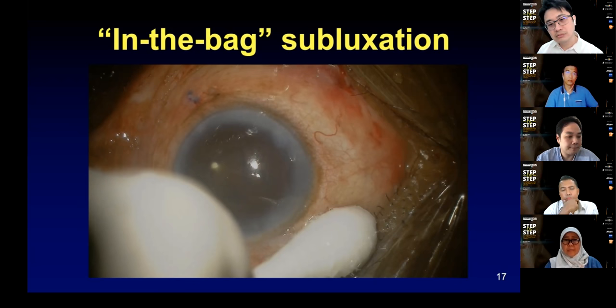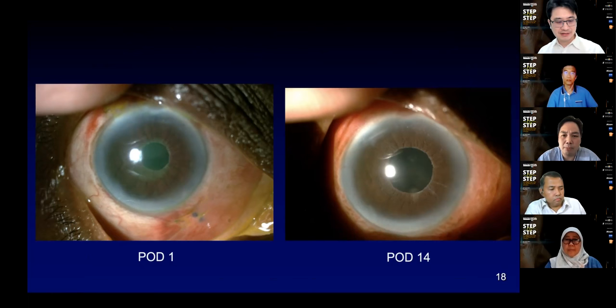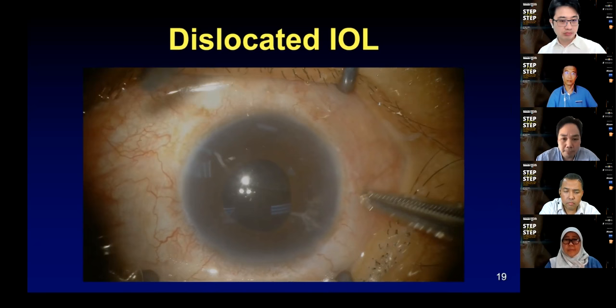So this is the patient on the first day and 2 weeks after. You've got a nice lens sitting there, and pressure is pretty good after the trabeculectomy. And the lens, of course, is still a very short follow-up. I think it's just got about 4 months of follow-up, and time will tell how long this lens stays in place.